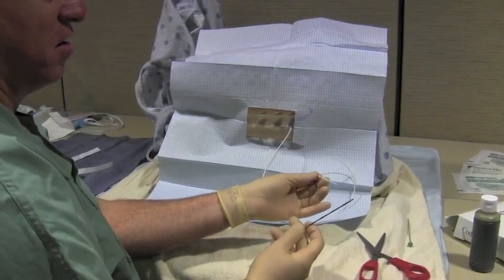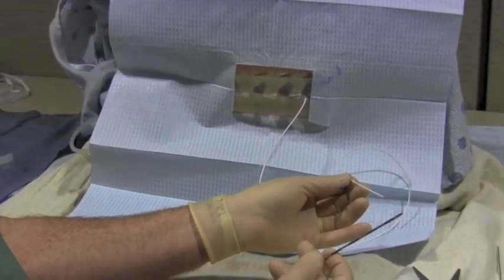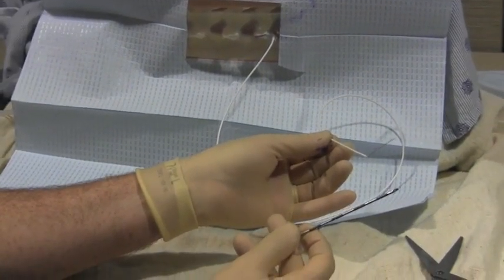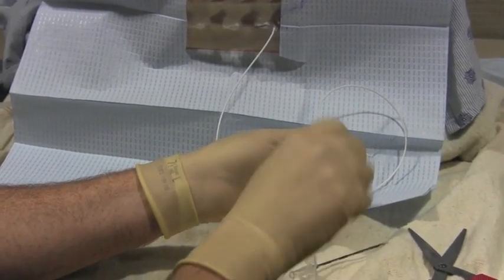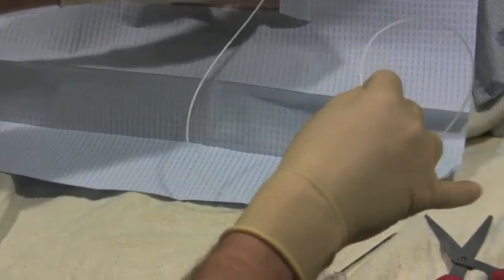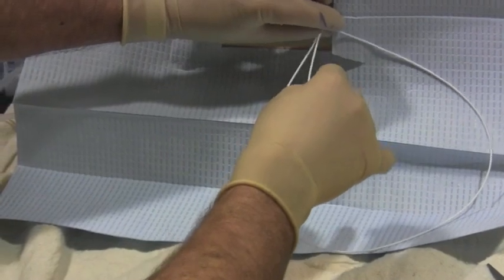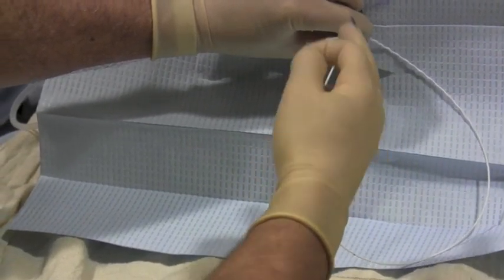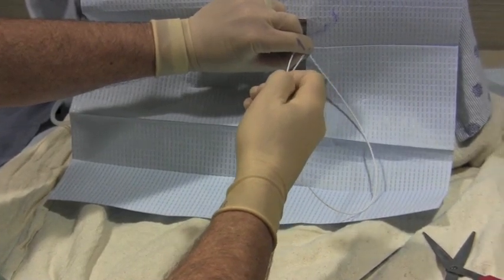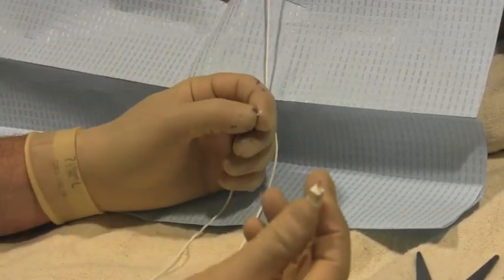The guide wire can be seen exiting the distal end of the catheter. This guide wire will now be removed while holding the catheter in place. At times there can be some resistance to pulling it, but gentle traction allows it to come off.